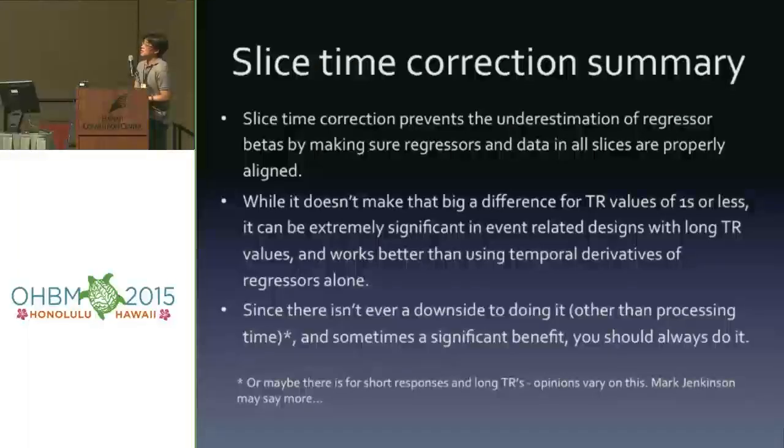Okay, to summarize, slice timing correction helps you line up your slices properly. It's going to help you a lot if you have a very long TR and if you do an event-related design. So it's very critical to use slice timing correction in long TR and event-related designs. And lastly, in our case, we suggest people do it no matter what. But Blaise told me that Mark might have a different opinion on this, and he's going to talk about that later.